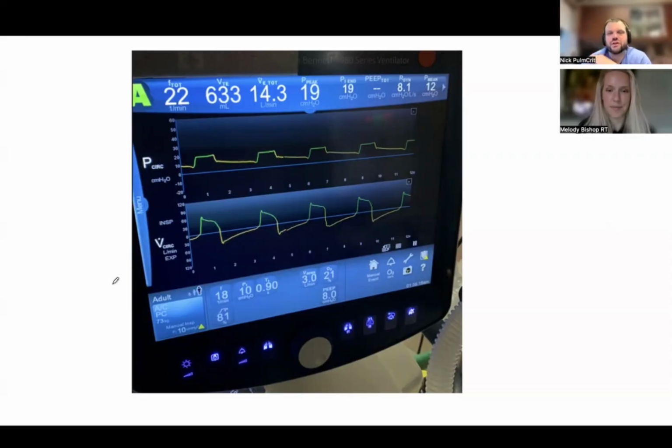Like, what are the possible things that could be going on? Sure, sometimes there's a very specific thing that happened, like somebody cut the ventilator tubing or something. But outside of that, we should be able to ascertain what's happening. So since this is your slide, can I diagnose it, I guess, and then we'll talk. I think before you diagnose it, I do just want to start off for people that are following along.